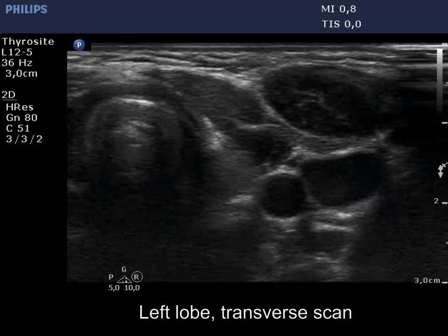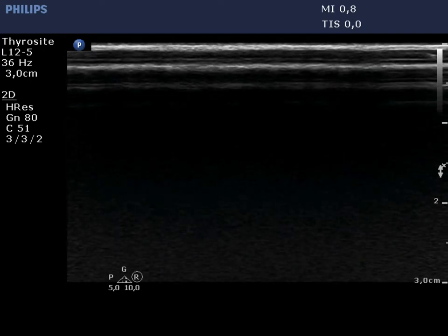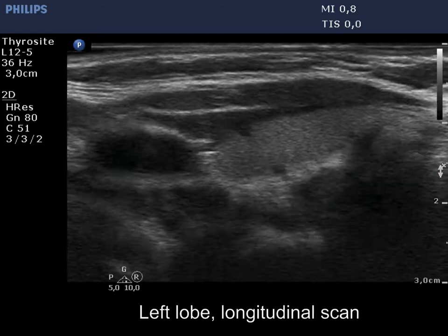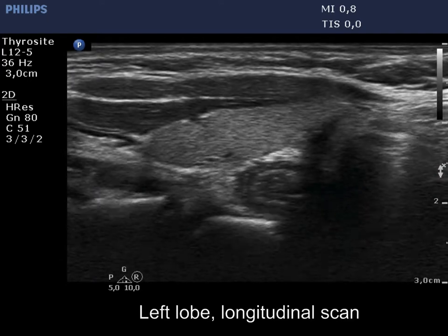The left lobe is also intact and has no discrete lesions. This is a healthy thyroid.